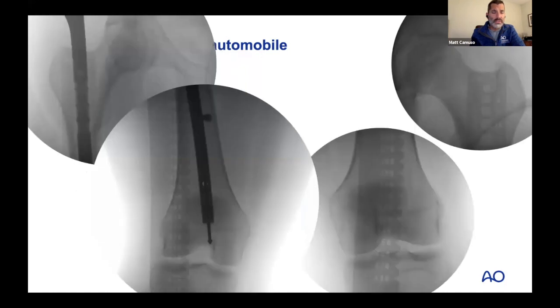Perhaps a little bit subtle in this case, but I think that blocking screw preventing varus in this more patulous distal femoral segment will help maintain alignment in this patient that has a wider canal than the size nail that I can place. And so here we are measuring the femur, again, comparing it to those images that we saved previously. And I can confirm at this stage whether or not I've got the correct length or not.